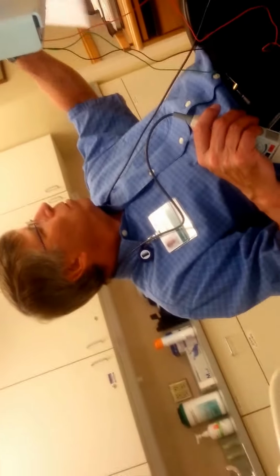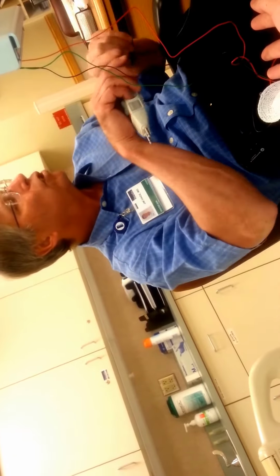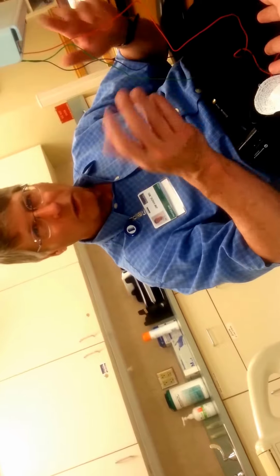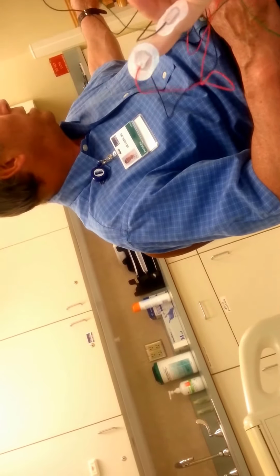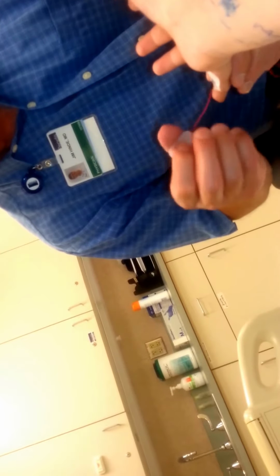So now we have normal nerve conduction tests. So we have to make sure, and this whole test may turn out to be normal if you have an overuse syndrome, just using it too much on a keyboard or something, you know. What do you do at home? Do you like gardening, or what are your hobbies? I like to play the guitar and scrapbook and use the computer. Are you always doing something with your hands? Okay. Yeah, because you can overuse muscles and get what we call myofascial pain, which is just like nerve pain, but it comes from muscles that have been used too much.